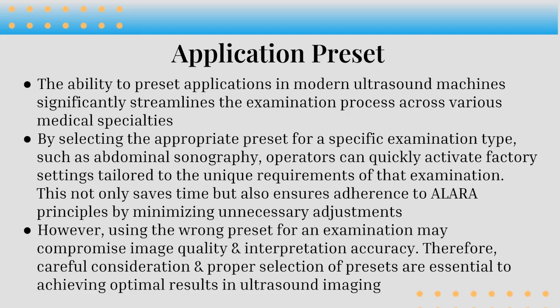So make sure when you're starting your exam, you select your proper application preset according to the type of exam you're performing. The presets allow for streamlining of the examination process across various medical specialties. By selecting the appropriate preset for a specific examination type, such as abdominal sonography, operators can quickly activate factory settings tailored to the unique requirements of that examination.